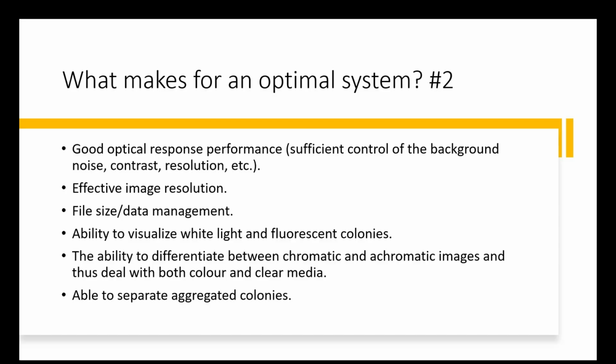We also want the ability to visualize all different sorts of colonies of different formations and different colors. So this might include chromatic and achromatic images, and be able to deal with clearer media and more densely colored media. We want the system to be able to separate out aggregated colonies.